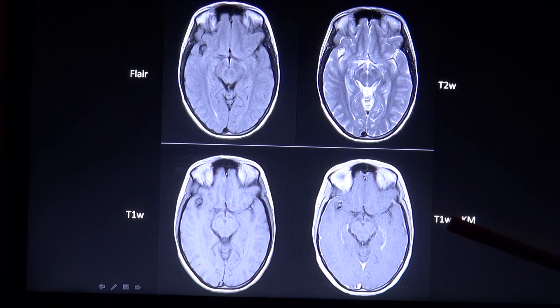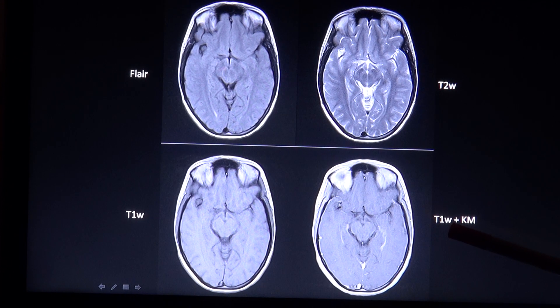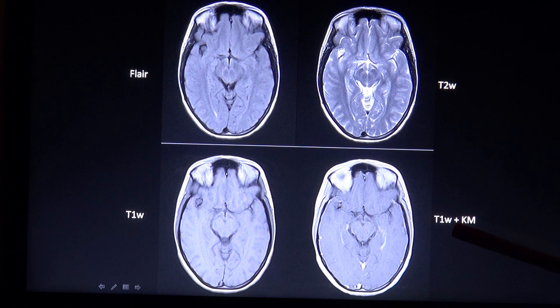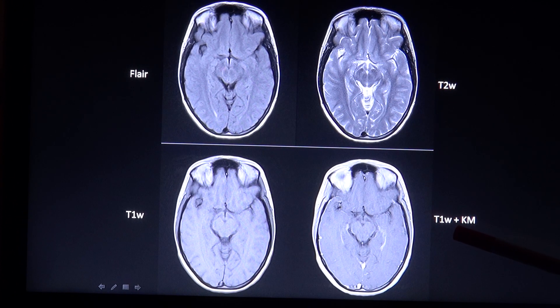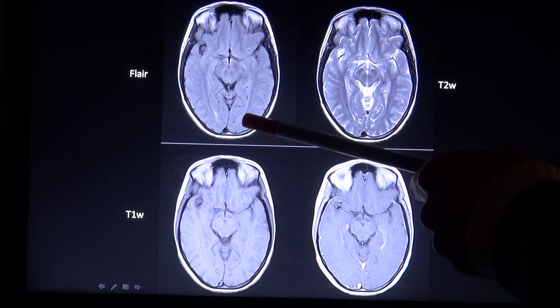This is the second part of the Basic MRI Sequences lecture. Additionally to the already mentioned sequences in the first part, there is another important and commonly used sequence, especially when imaging the brain, which is called FLAIR, also known as TIRM.